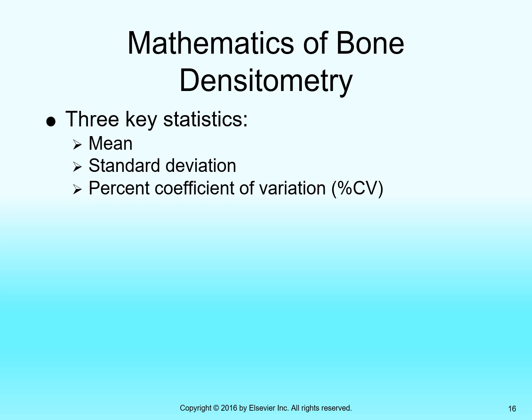And then percent coefficient of variation, that's the best number to kind of objectively view the data if you happen to have a patient that is getting scans on multiple different machines from different manufacturers. Percent coefficient of variation gives you kind of an estimate of how universal this is compared to other machines.